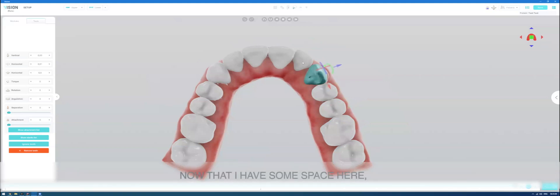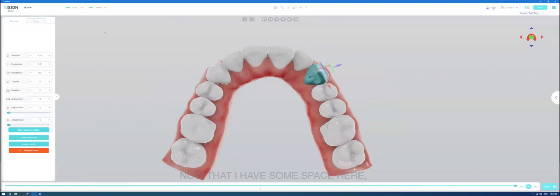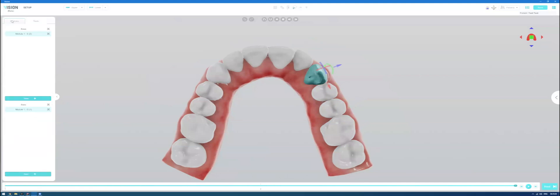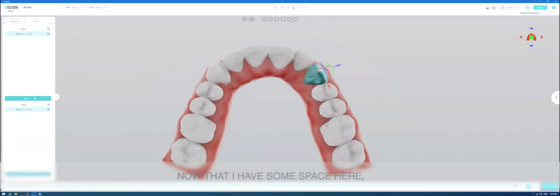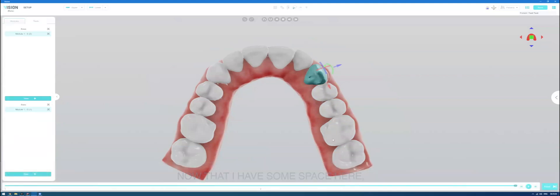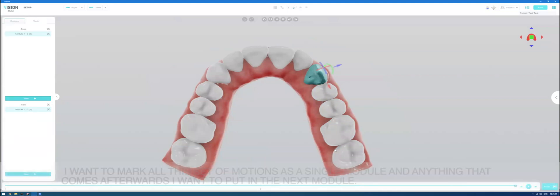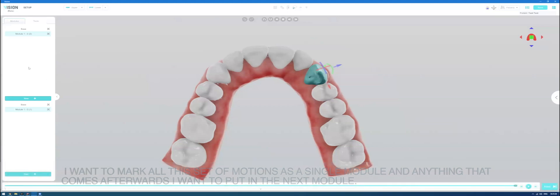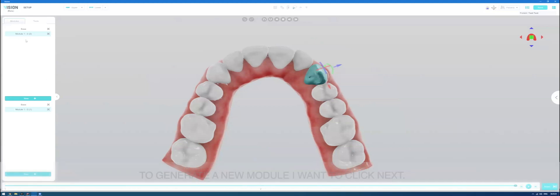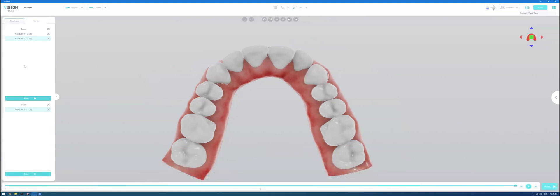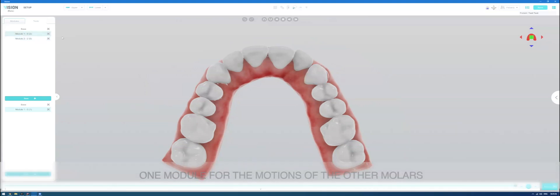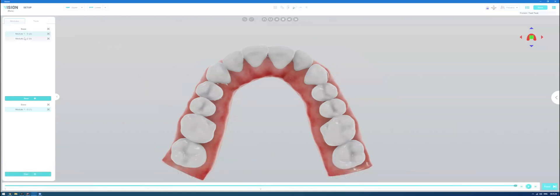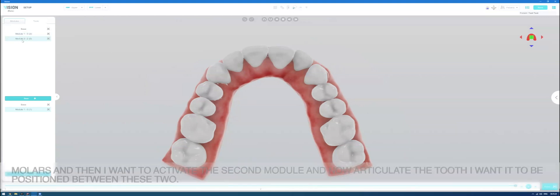And now that I have some space here, I want to mark all of this set of motions as a single module and anything that comes afterwards, I want to put in the next module. To generate a new module, I want to click Next.